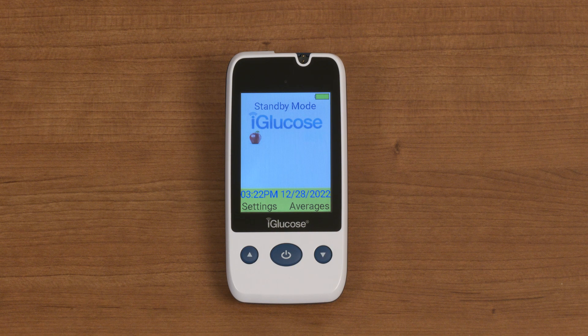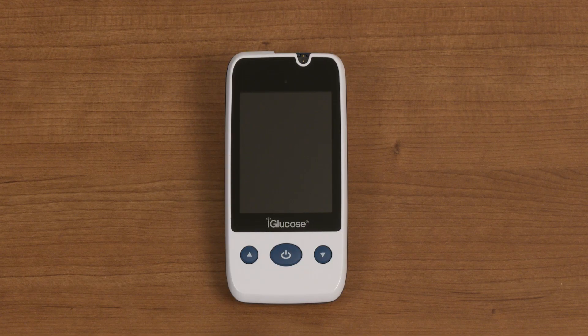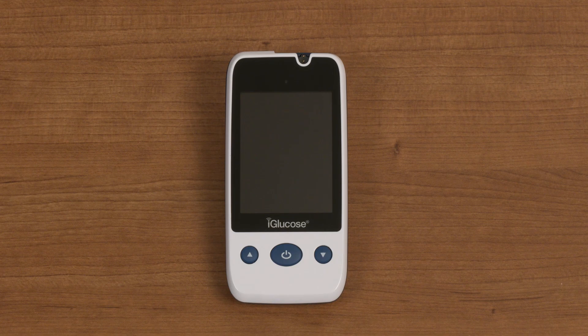Depending on which model of the iGlucose Meter you have, the device will remain in standby mode for 30 to 60 seconds before the display goes dark, unless you have inserted a test strip. Once you have inserted a test strip, the device screen will remain lit for 120 seconds before going dark. If the meter goes dark, the display will come back when you press any button or by inserting a test strip. To turn off the iGlucose meter, make sure the screen is lit by pressing any button, then press and hold the home button for three seconds.